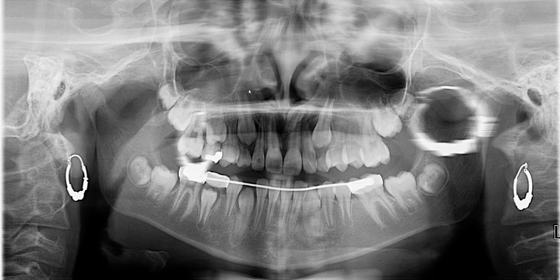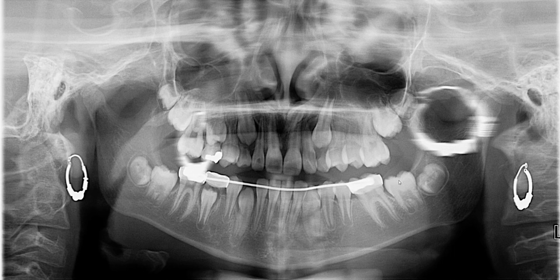Let's go through this panoramic radiograph. There are many ways of determining the patient's age, but I generally like to visualize the position and eruption status of the first molars. We'll call this the 6-year molar and the 12-year molar. The 6-year molars are erupted, certainly not the 12. Then I look at the central incisors — both maxillary and mandibular — and the central and lateral incisors are fully erupted in both arches.